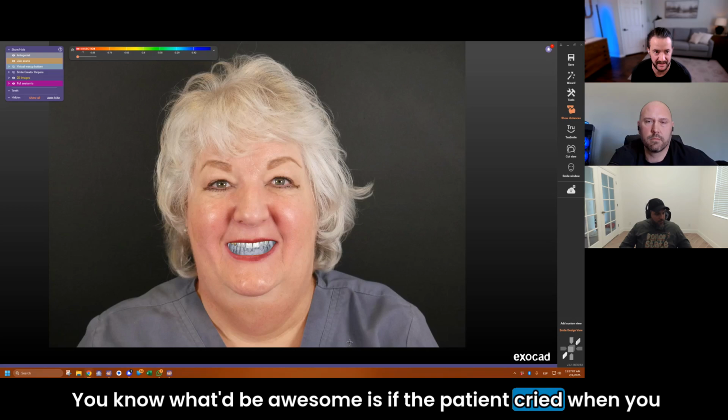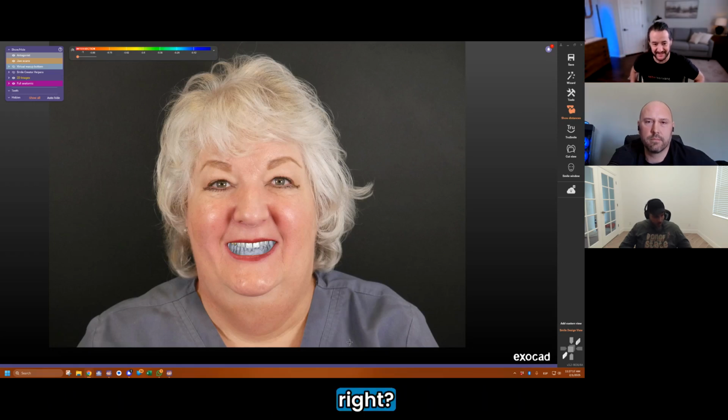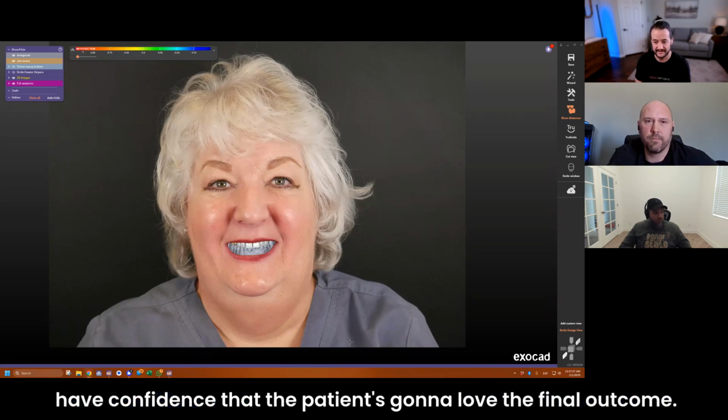And we can give the patient exactly what they had in mind or very close to it. It'd be awesome if the patient cried when you delivered the 3D mock-ups in their mouth, pre-preparation, right? Because then you know you're three-quarters of the way there. If they love the mock-up that they're wearing, the length and width and the way it feels on their lips, then we have confidence that the patient's going to love the final outcome.